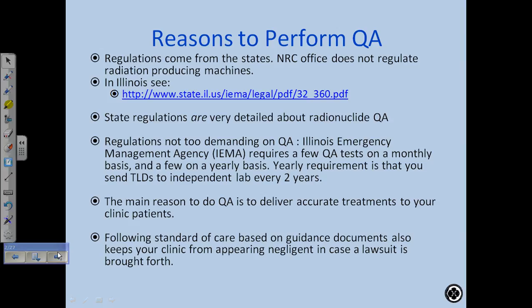It includes continuing QA, in other words, improvement of QA. And then it includes all the equipment that we look at. We look at equipment QA such as electrometer QA, chamber QA, all the instruments you use, MapCheck QA, daily dose checker QA, and then the accelerator QA, CT Sim QA, HDR QA, right? Stereotactic radiosurgery program QA. And so it includes a vast majority of everything we get involved with.